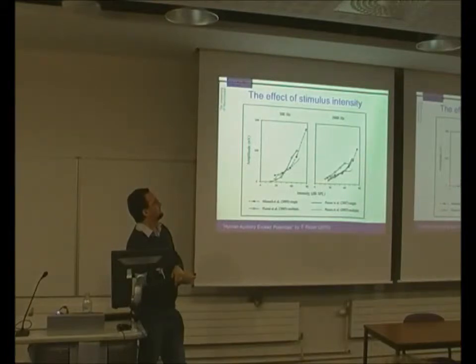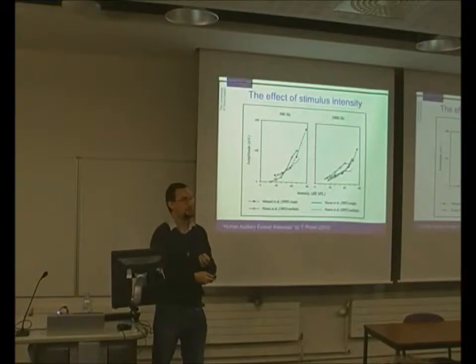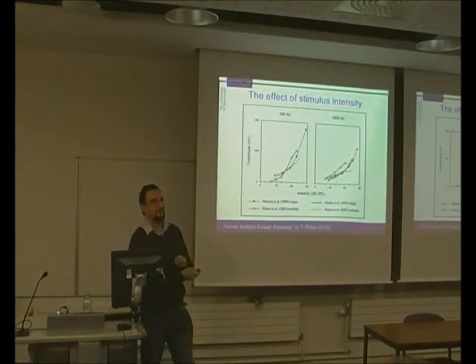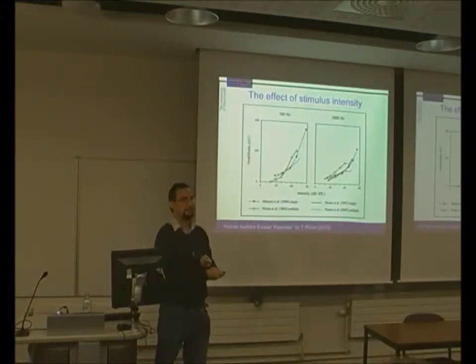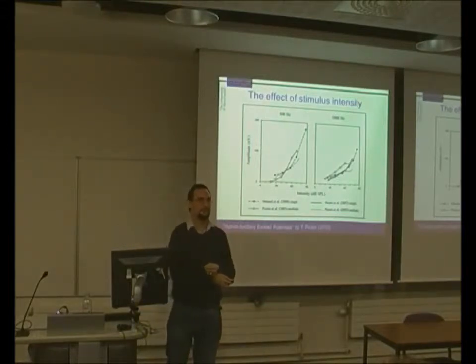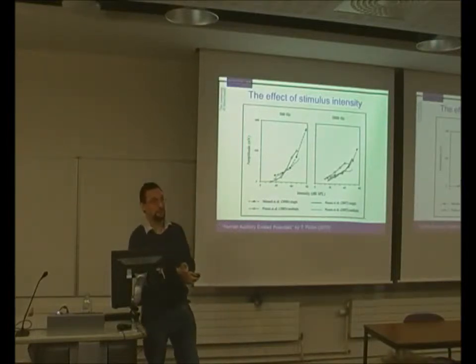So when we're doing threshold estimation, it's important to note that like all other EEGs, when we evoke potential responses rather to auditory stimuli, when we change the intensity of the signal, the amplitude we get out changes. So for very high intensity stimuli, we get strong amplitudes. And as we go down and down and down, closer to threshold, the response amplitudes become diminished. And that's quite important when we're trying to find the threshold estimation, because it means we need good recording conditions.